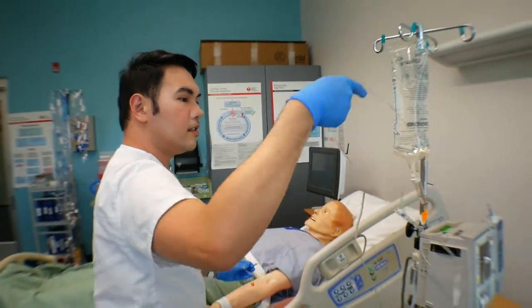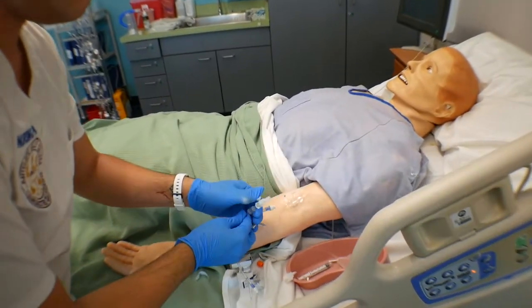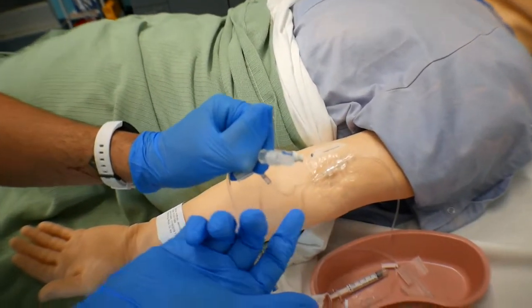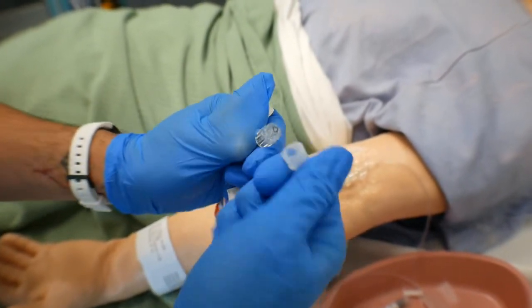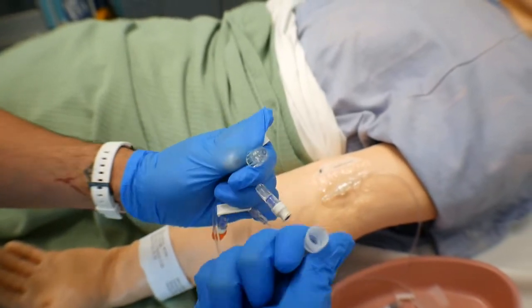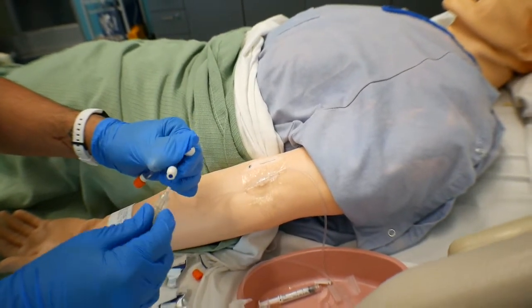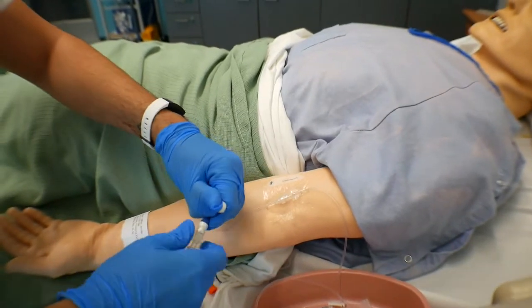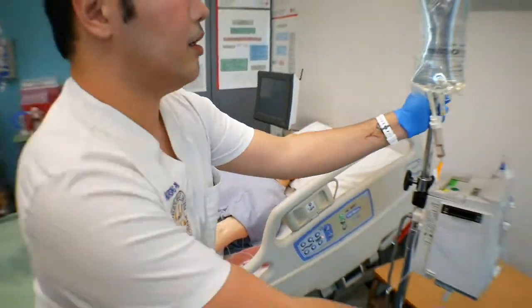We'll take this. Tip for this, like students are having a hard time taking this off. It actually takes off when you pull it like that. So you don't rotate it. So just pull it down, like snap it. Okay. I've already swabbed my Y side, so I'm ready to snap it in. Alright. So after that, we're gonna go back to our pump.